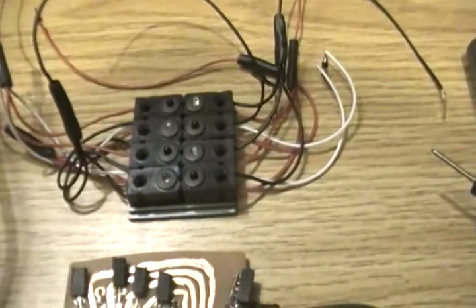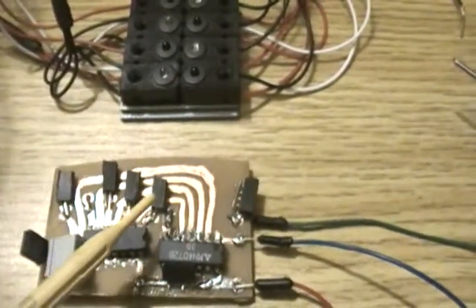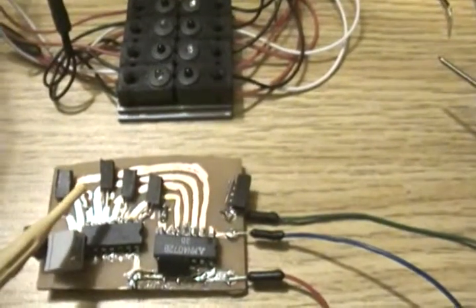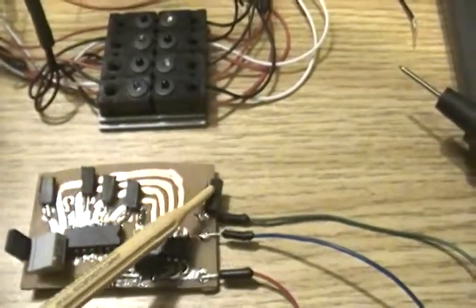So let's start with the white wires. The white wires, they go here. 1, 2, 3, 4. All the white wires. It doesn't matter which order you plug them in. So this is the electronic board. Now all the black wires, they go here.